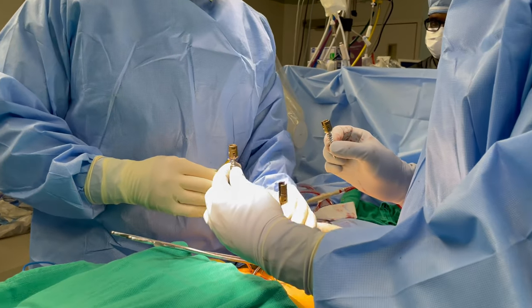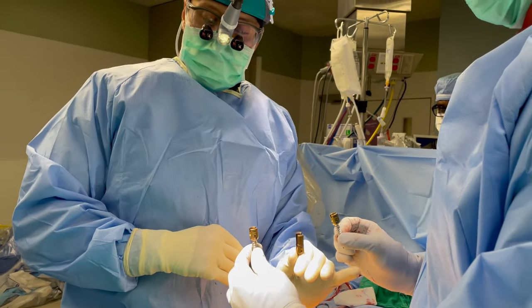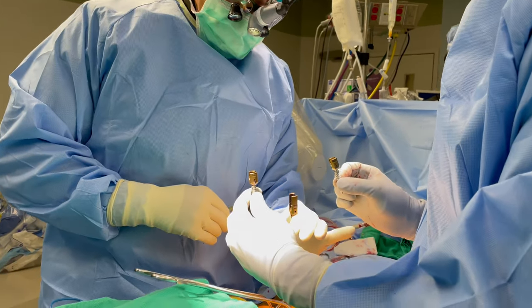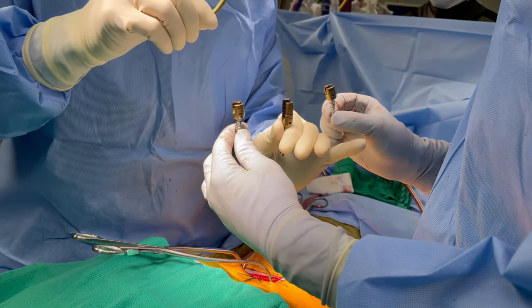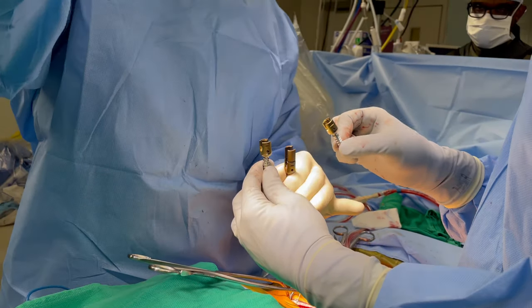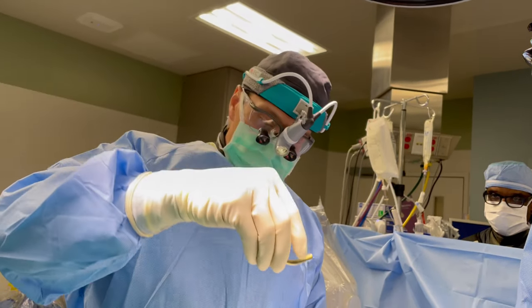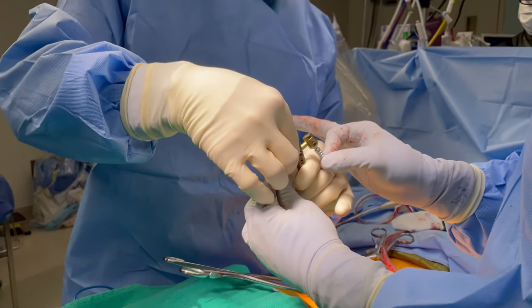That bone, as a result, is forward — way forward in the spine, and I'll show you a picture of that later. So when I look in the spine, this is what I see: one screw is placed really deep, the other two are placed at a normal height. We put the rod in between these screws — you see how I bent the rod to get a normal curvature in the spine? We put this in these screw heads.